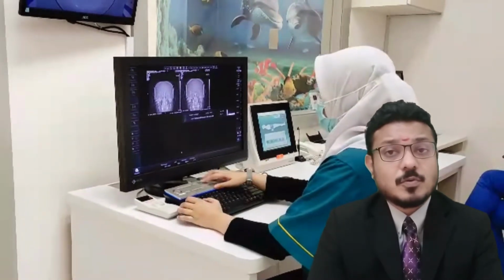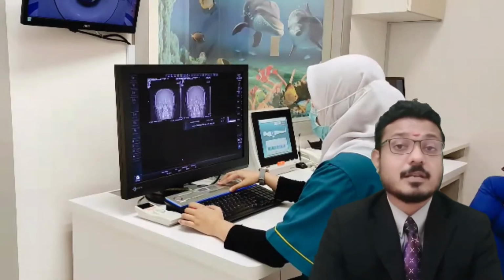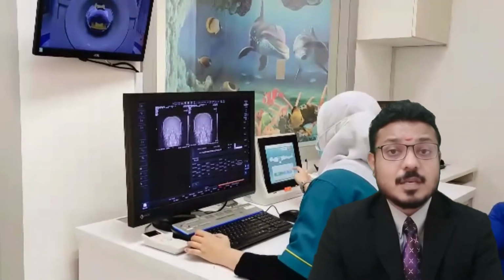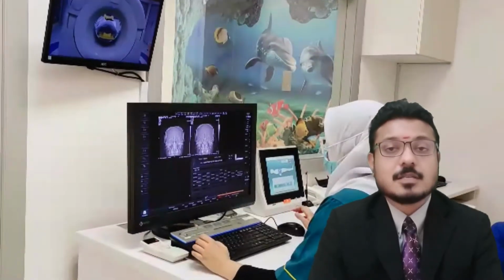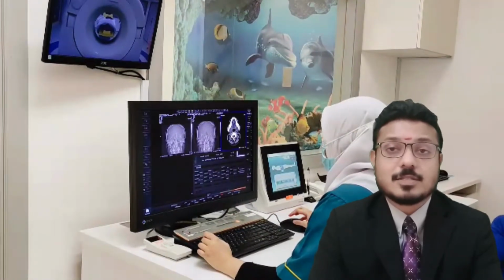They can show the soft tissues, blood vessels and bones in various parts of the body. A CT scan may be used to visualize the head, shoulders, spine, heart, abdomen, knee and the chest.